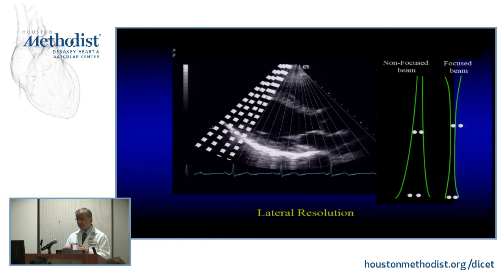Lateral resolution is a different ballgame, because if you think of these scan lines, they're not a line. They're basically a little tube that gets wider and wider the further you go away from the emission. So you could see that non-focused beam. There's a focused beam, so you could almost have an electronic lens, if you will, that focuses the beam. You'll see that at times, as in this one here. See this arrow? That tells you where the focus is of that particular ultrasound. So you could change that, you could bring the focus up and down. We don't do it as much, but at times you may want to, but most of the time I think we've done well without changing the focus much.